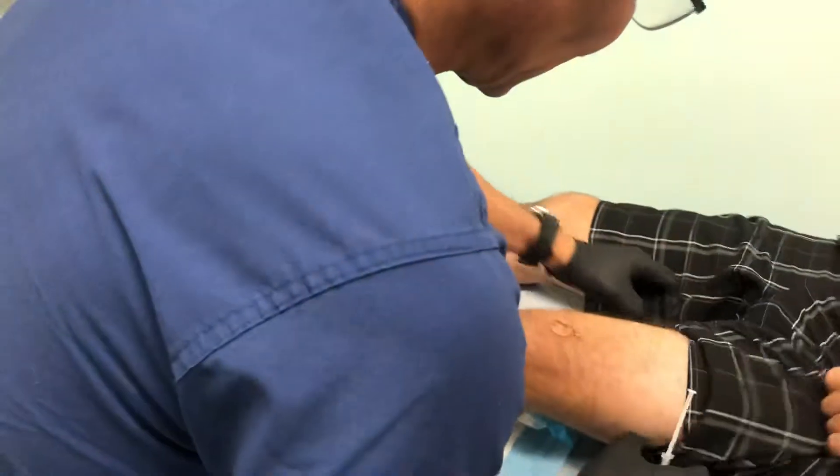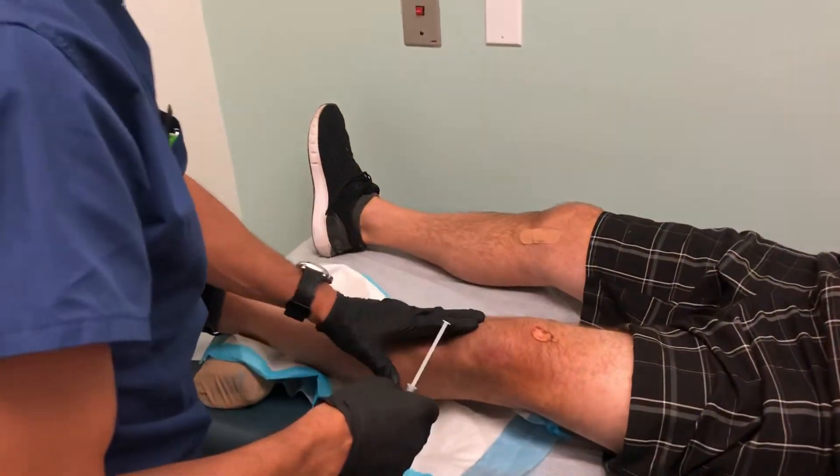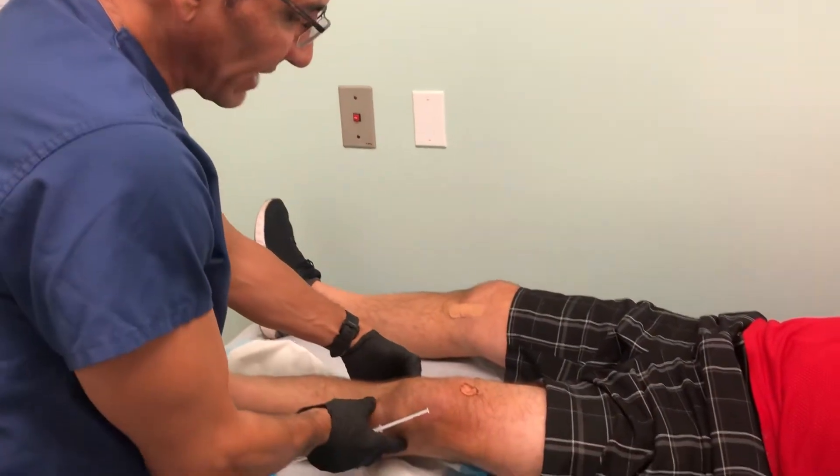Mr. Marion has a little bit of arthritis, mostly medial compartment, so if I do this really hard, he'll probably say ouch.